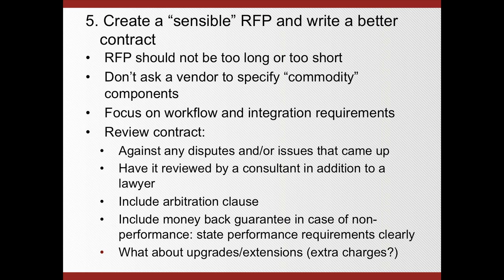Now, with regard to the request for proposal, make sure you create a request for proposal, even although it's relatively small or limited. If you don't have requirements for your system, there's no way you can actually find out whether the system meets your requirements. It doesn't have to be too long. I've seen RFPs of 500-600 pages. That is definitely overkill.